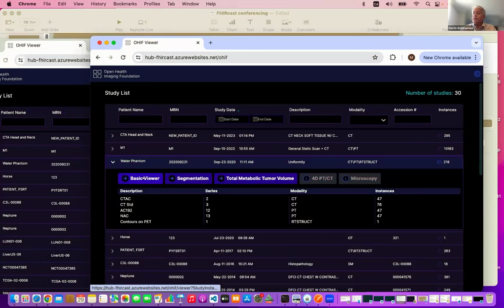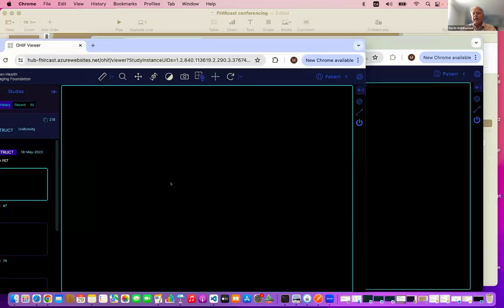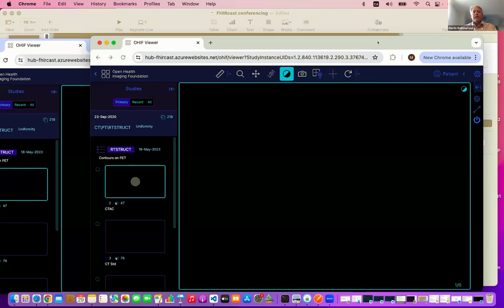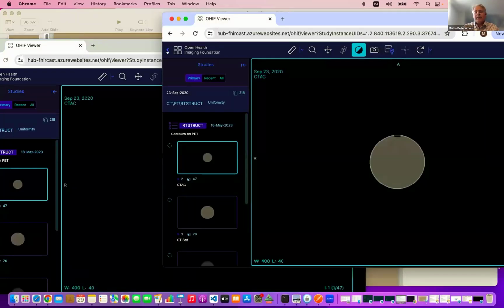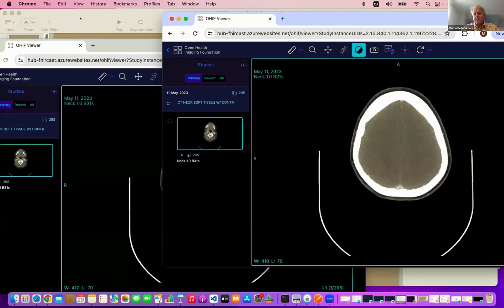So when I open the first study, you're going to get a message saying, do you want to participate in this conference? Just say yes. And now you should, like me, see that one viewer is following the other. So everyone in the conference is watching the same thing. So I can close the study, go to the next one, and you should see the same thing happening on your desktop, on your viewer, because we're all connected together through the hub. All right, so that was my demo.